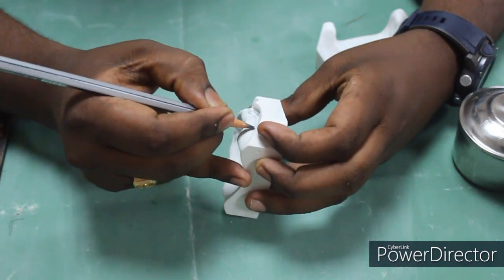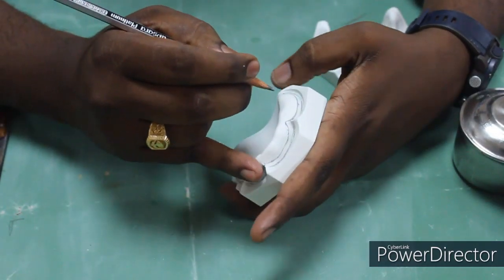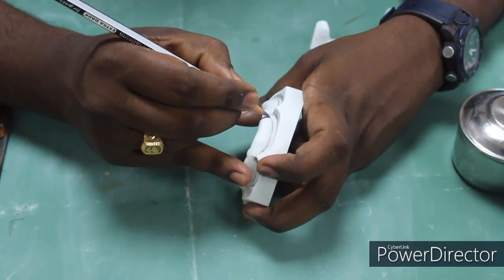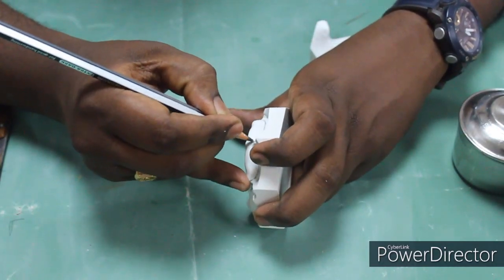So I am drawing 2 mm short. Now I am going to highlight this second line I drew. This is the tray line. This will be 2 mm short.